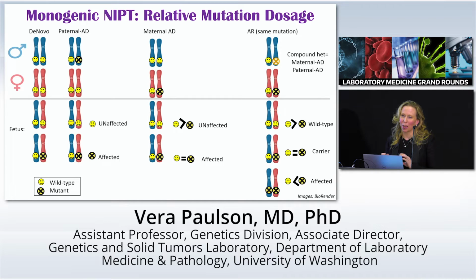It doesn't work so well if you have large structural alterations or deletions, or you have genes that have a pseudogene or they have repetitive regions. That requires something else, right? Because you can't do these counts for something you can't count well.